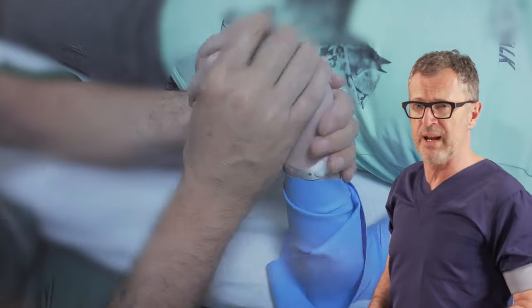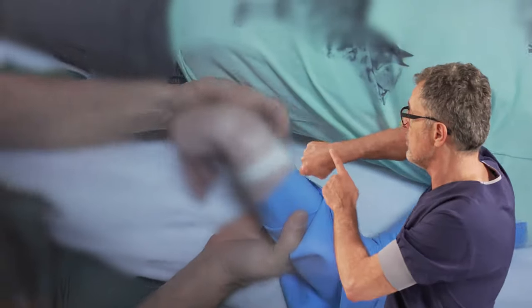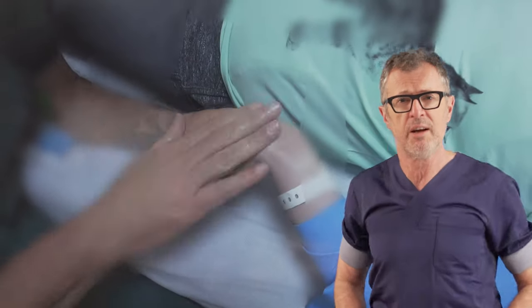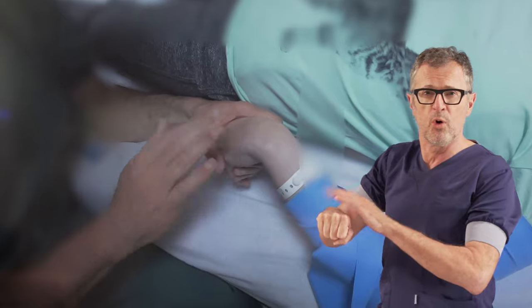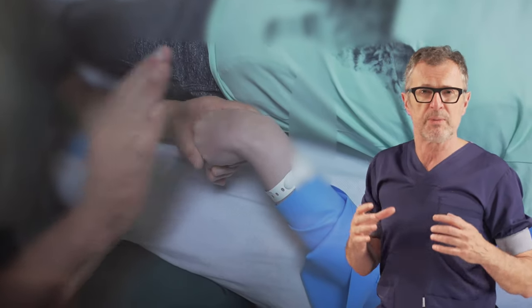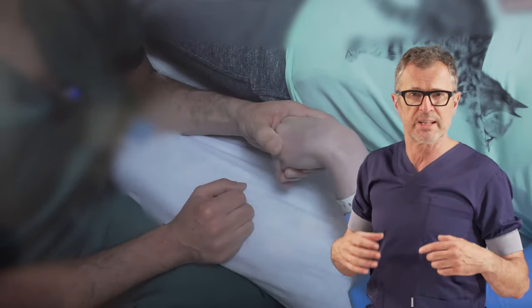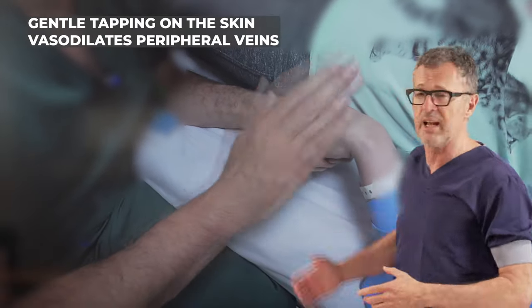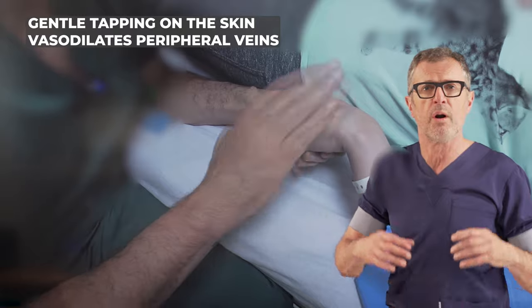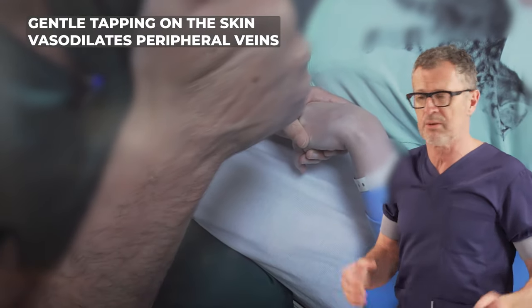In this situation, we have now identified a couple of peripheral veins. We would prefer to do that on the dorsum of the hand rather than on the volar side. Slight tapping over that wrist will cause the local tissues to release inflammatory mediators, which then tend to dilate the superficial veins and make them a little bit more accessible and easier to recognize.